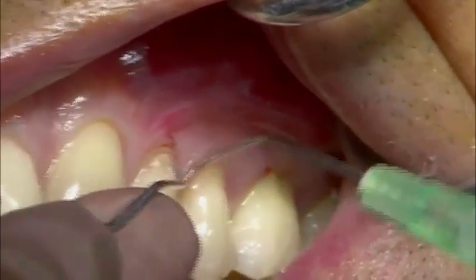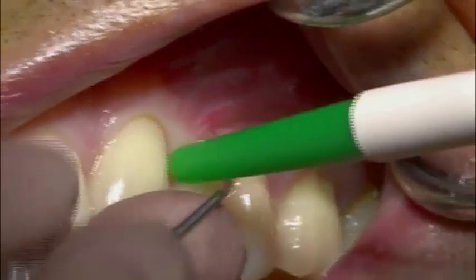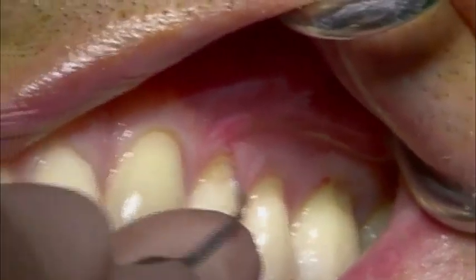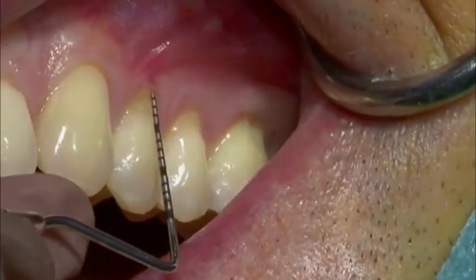The mechanical treatment is terminated when the soft tooth structure is completely removed and the root surface feels hard. The gingival displacement is then measured using a periodontal probe.